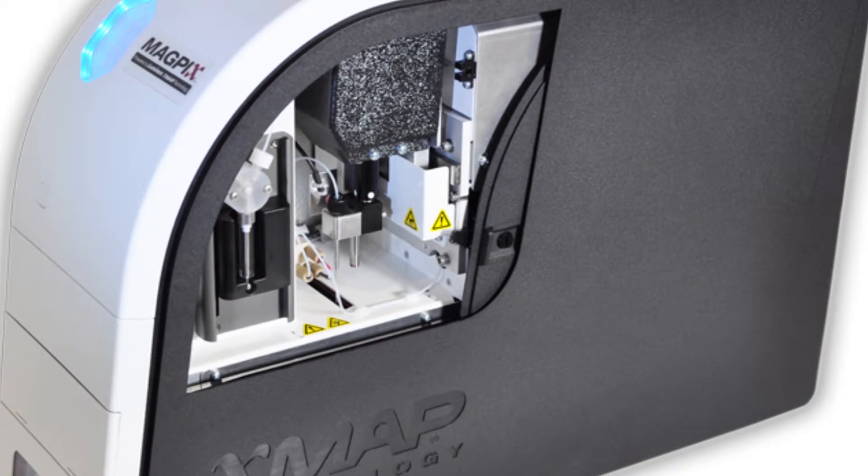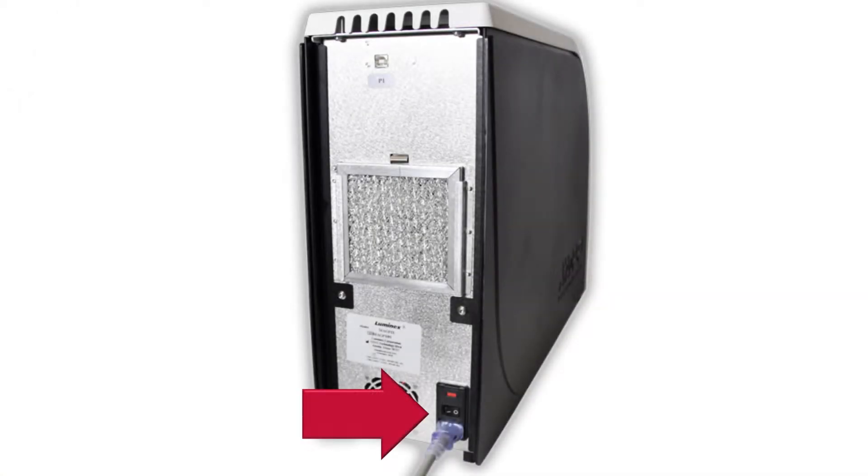The side access compartment of the MAGPIX instrument contains the majority of user-maintainable components. Before opening the side access compartment to perform maintenance tasks, turn off and unplug the MAGPIX from the back of the instrument. Let's go through the steps to perform the annual maintenance tasks.